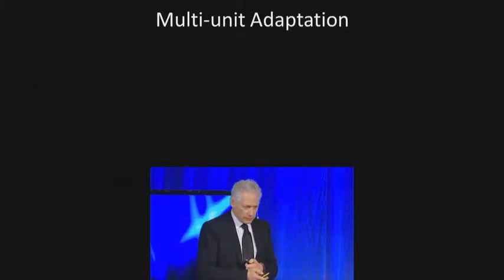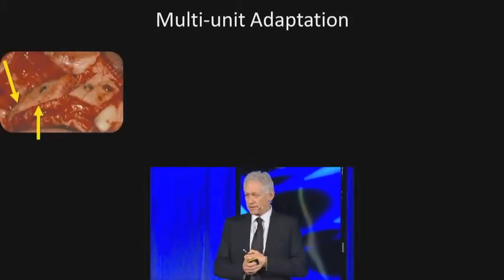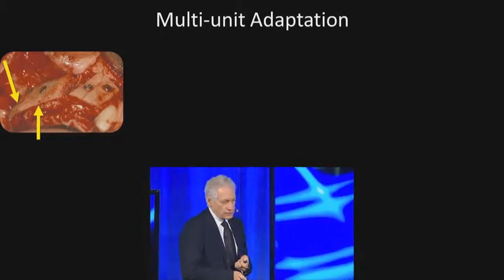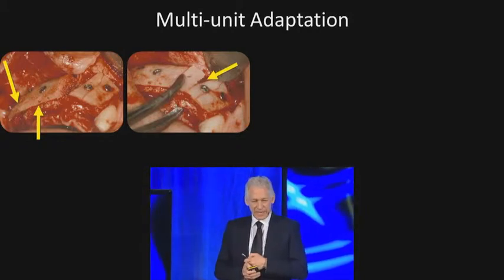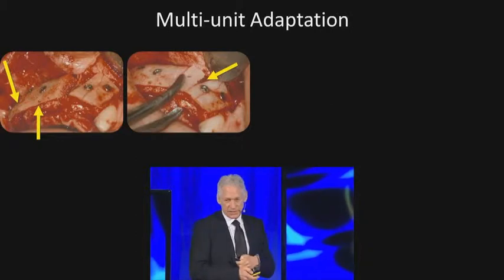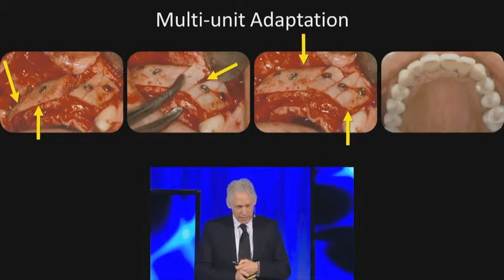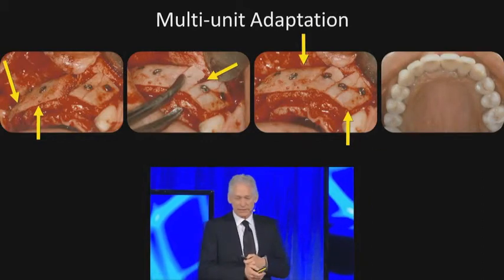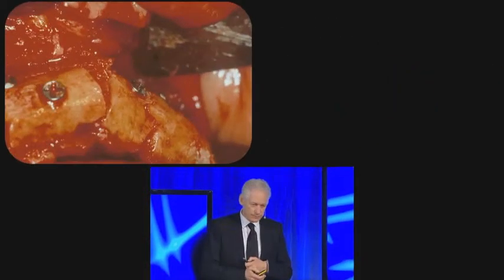cause early exposure. Now, in some of our older patients, the bone is much thinner, so we'll use multiple units, such as here. We'll create one area, a piece is missing, we'll fit the puzzle. Again, it's completely beveled well away from the teeth. And stabilize it. When you reconstruct it horizontally and vertically that way, you will get the reconstruction as planned.